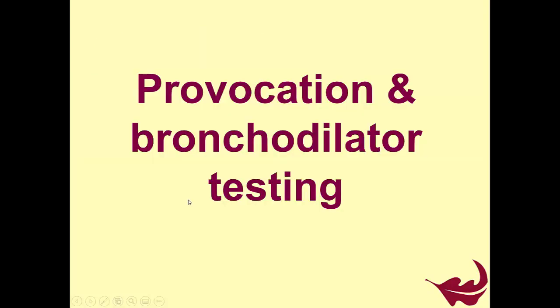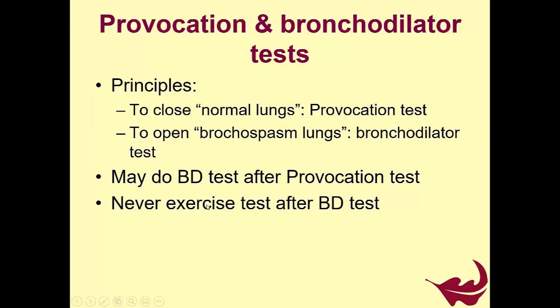When it comes to provocation and bronchodilator testing, the principle, of course, is when we see a diver and they give us a history and say that when they start running, they get a bit of a wheeze, etc. We might be doing spirometry on them that is absolutely normal. But with that history, we might be missing something significant.